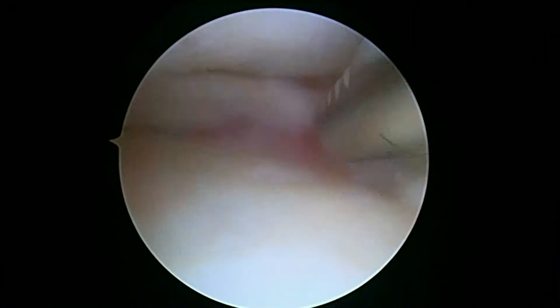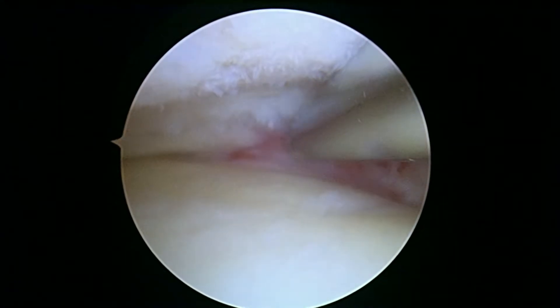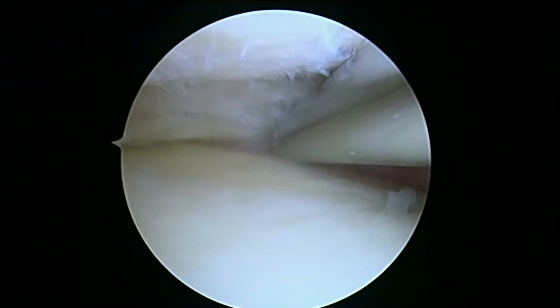We can see there's quite a bit of irregularity in the femoral condyle up above also. I'm going to need the light wave wand. Okay, and so now we're going to go ahead and go off on the video just for a minute and get to work on this posterior meniscal tear.